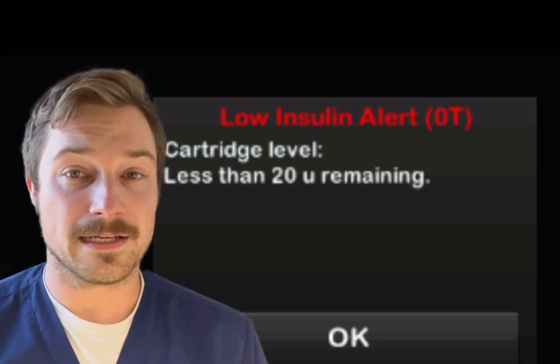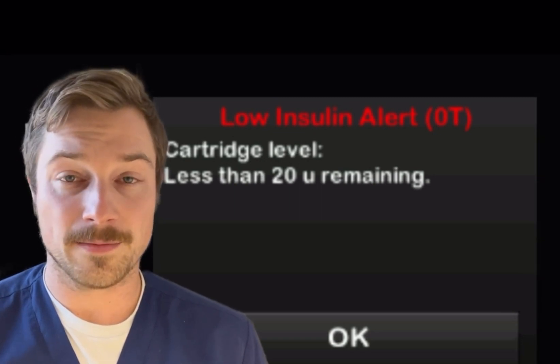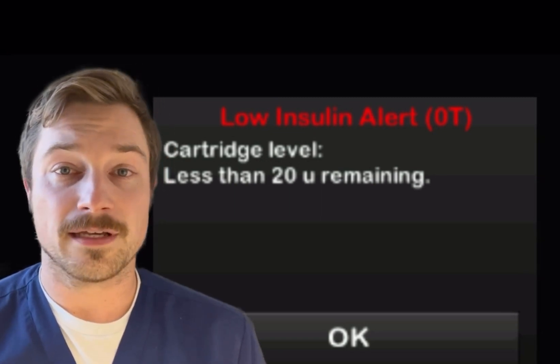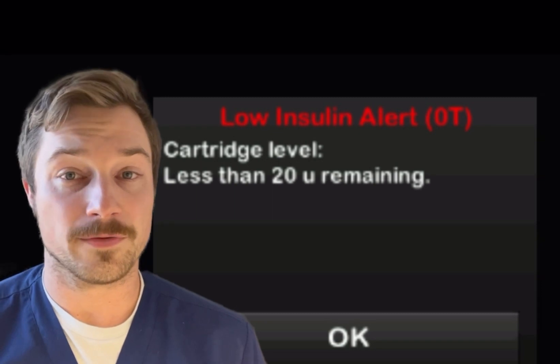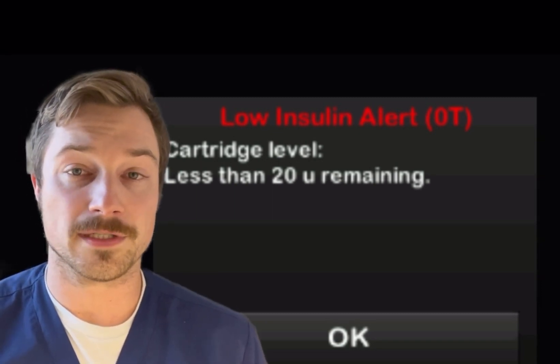I do recommend you keep it at either 20 or increase it to 40, whatever your choice is. But again, if you want to use the 10, that is up to you and your healthcare provider. Always consult your healthcare provider for further questions.